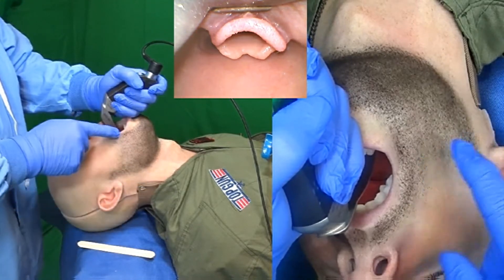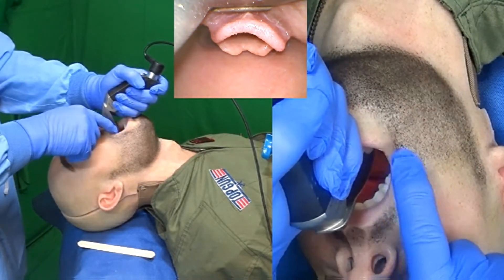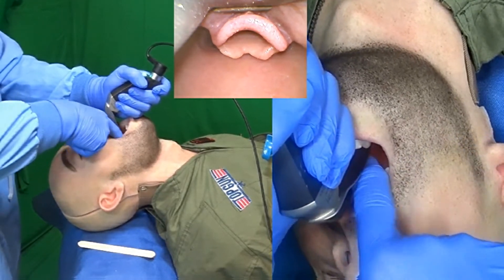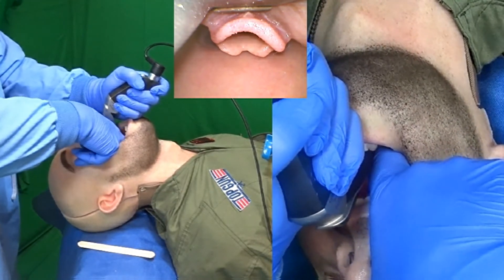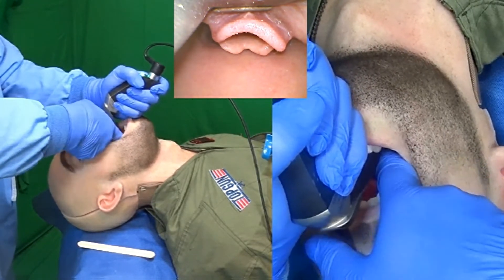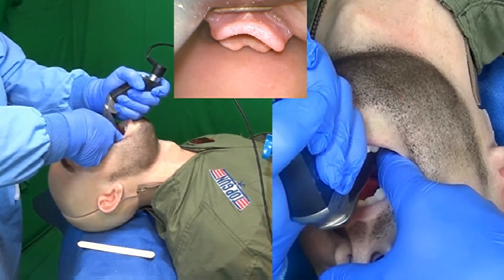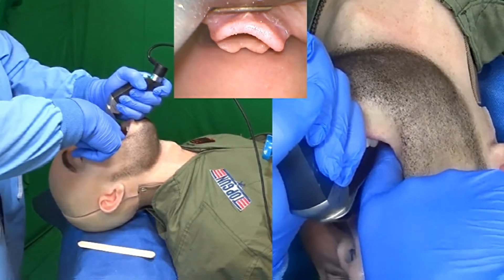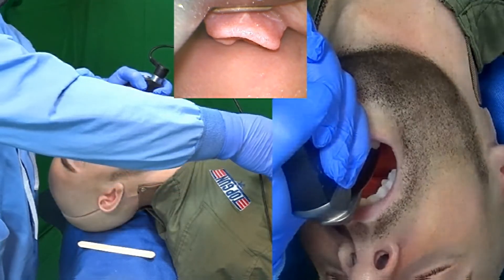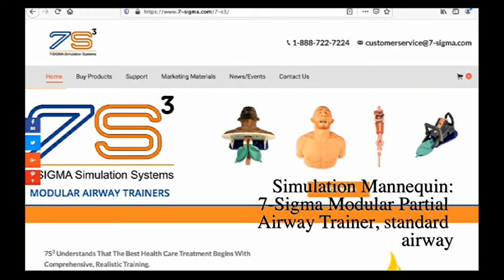Prior to tracheal tube delivery, I want to make sure that I don't have any of the patient's tongue hanging over the delivery channel. I can place my index finger into the mouth, and if the tongue is in the way, I can push it to the left of the blade. This also dilates a tract for tracheal tube delivery, which is very important with certain video laryngoscopes such as the GlideScope.